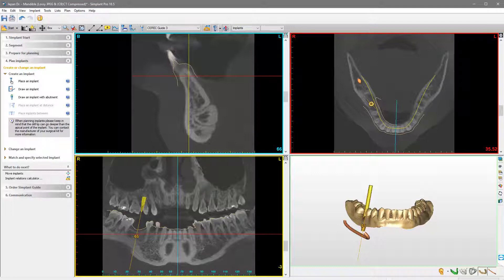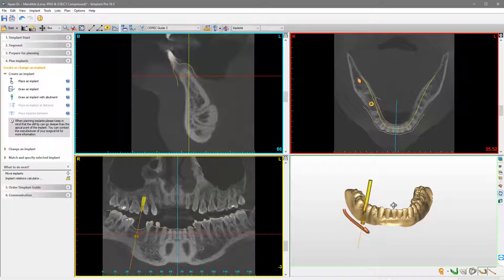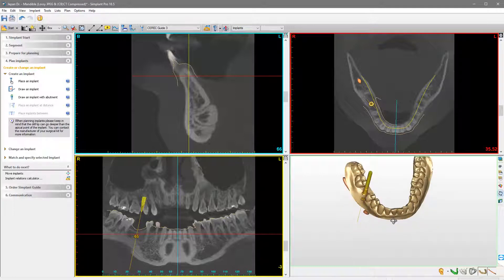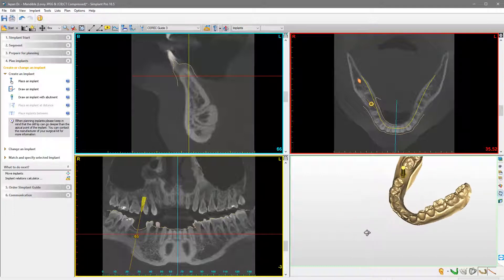These colors are also visible in each other view. For example, you can see the blue line that represents the current cross-section slice and the yellow line that indicates the current panoramic slice. In order to rotate the 3D view, press and hold the right mouse button down and move the mouse.